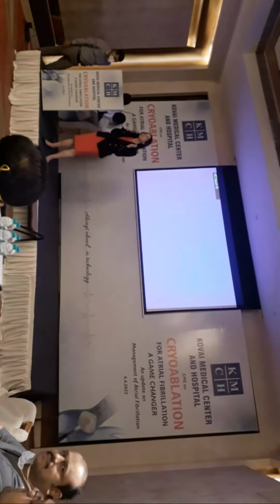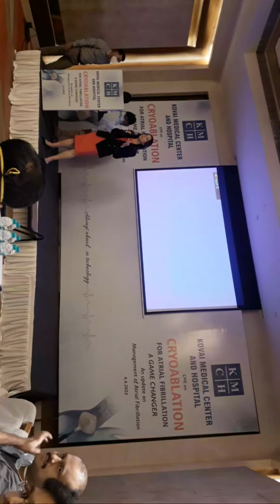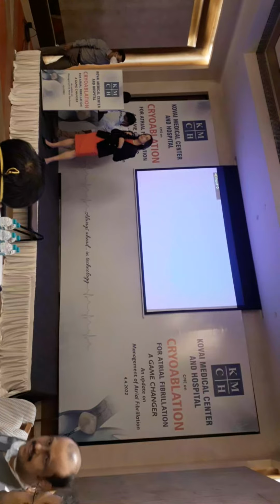I started doing my first AFib ablations with radiofrequency in the early 2000s, probably about 2004. At that time we did something called WACA, which was wide area circumferential ablation. That was preceding any mapping system, preceding any CT imaging. We weren't able to segment it and enter it into our procedure at all.